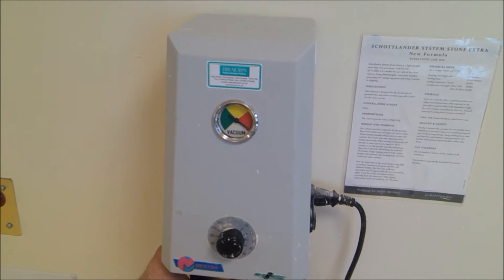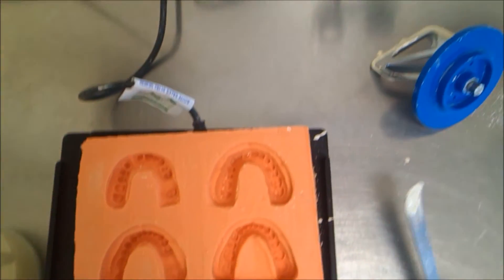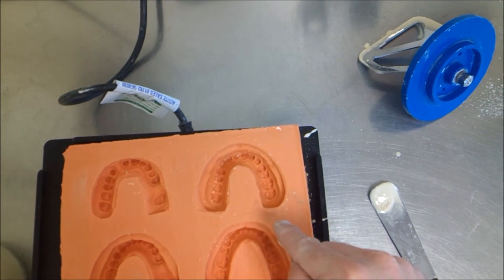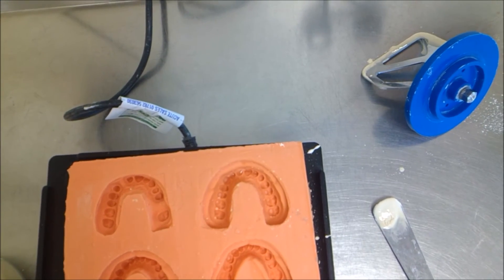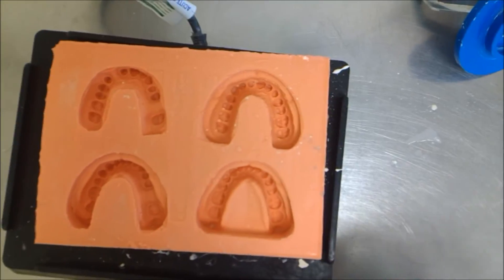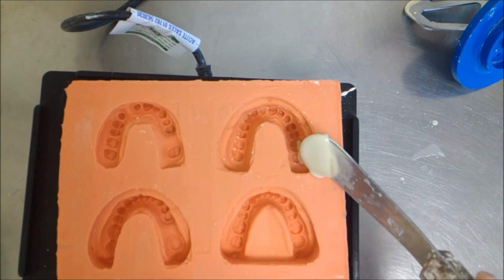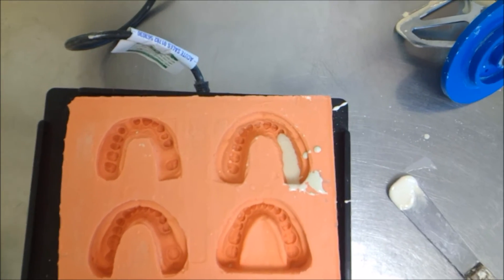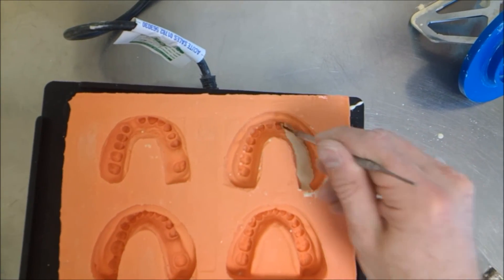Okay, vacuum's released. You can begin pouring the material into the mold. I've wet the mold, but you can also add a surface wetting agent such as water with a small drop of detergent. I'm going to use the vibrator in this instance. I'm going to begin by pouring the die stone in at the end of the mold, and I'm going to ensure with an instrument that my material has reached the prepared areas.